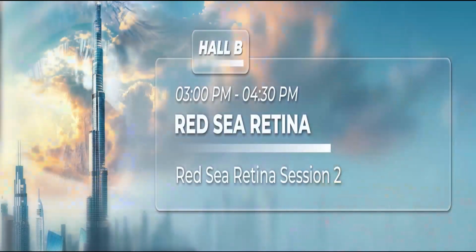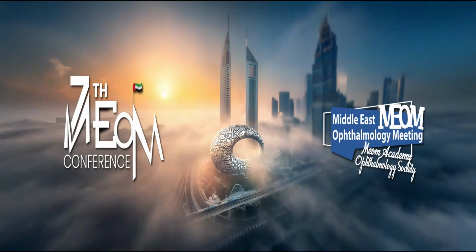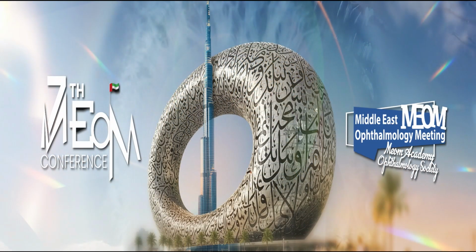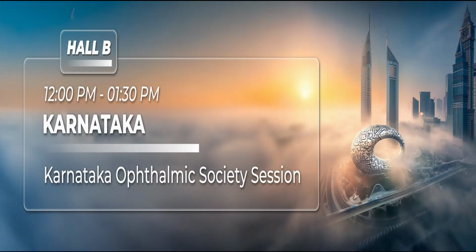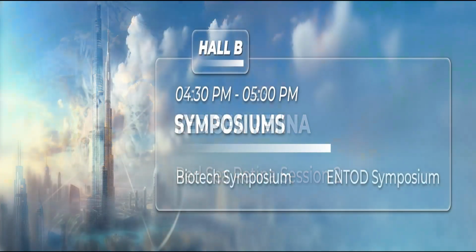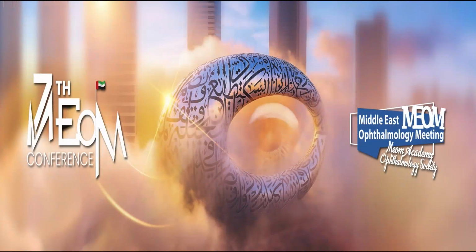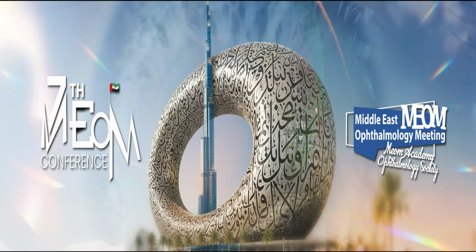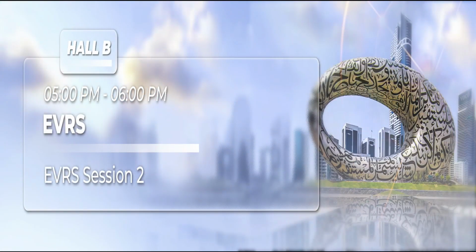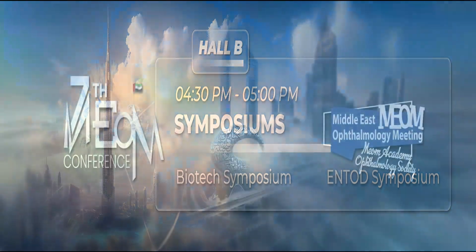The GRT is a very challenging case, and I think the idea of direct PFC silicone oil exchange is very helpful to avoid slippage and re-operating on the case from the start. Some people think about PFCL air exchange first, but I think if you get slippage once, you will regret it and go for the direct PFC silicone exchange. This is exactly what happened with me.